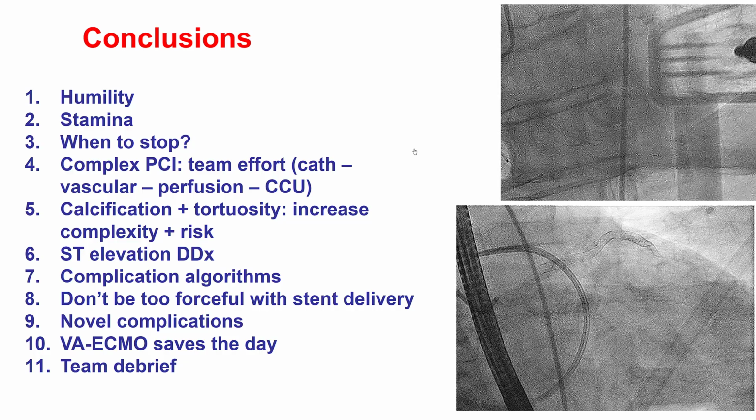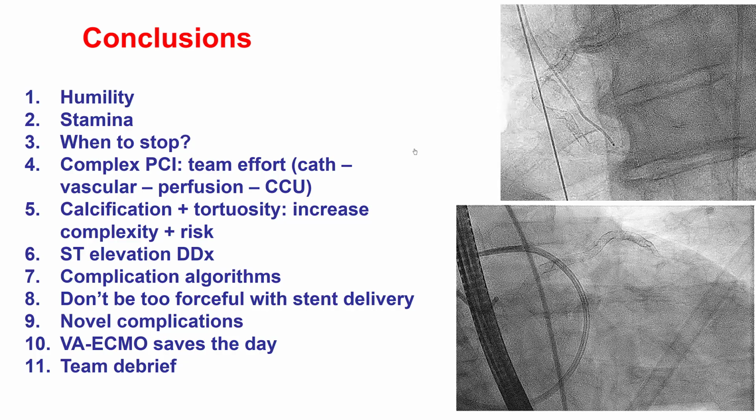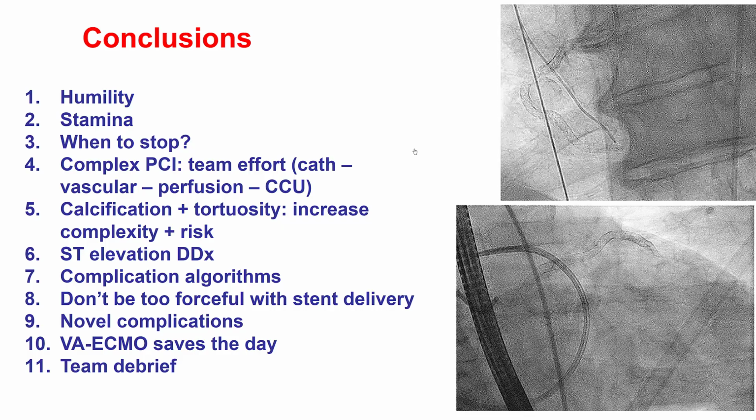Another lesson is the importance of having algorithms for treating complications, algorithms for acute vessel closure, for perforation, for hemodynamic instability.